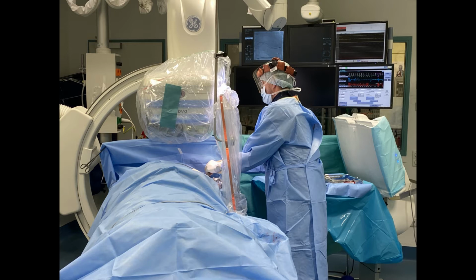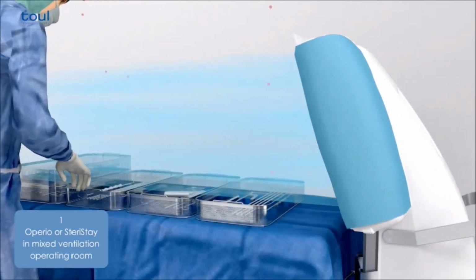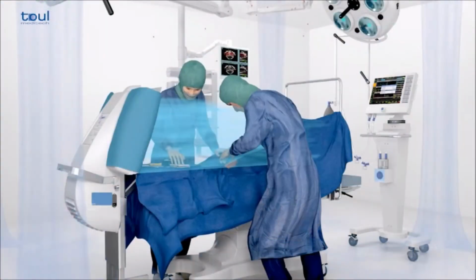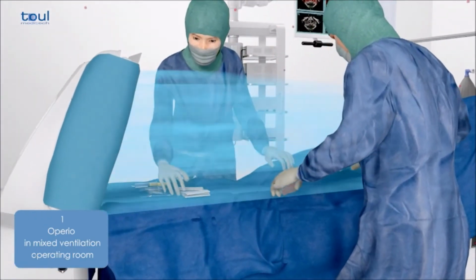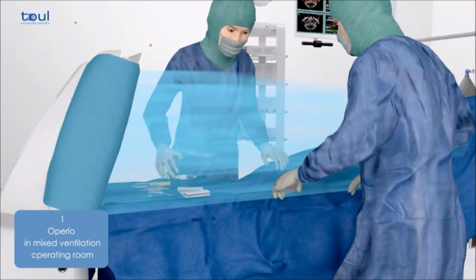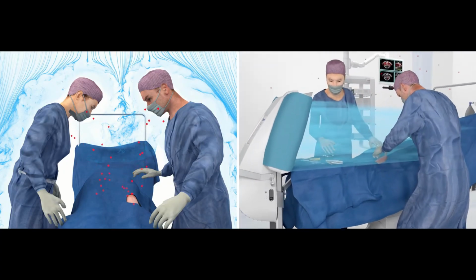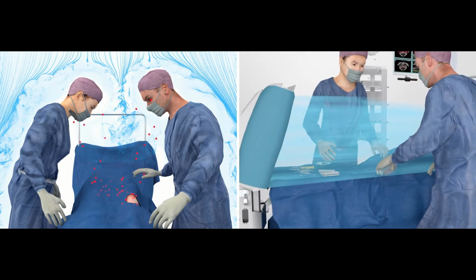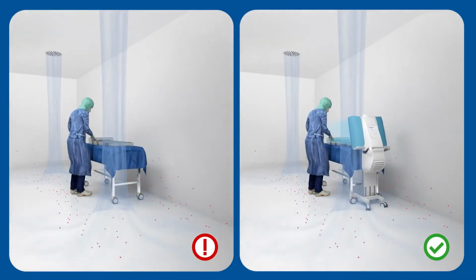Focused laminar flow. In the case of focused laminar flow systems, the air is filtered through HEPA filters free of microorganisms and then directed immediately onto the surgical instruments and surgical site. It is only then distributed throughout the operating theatre. This protects the critical area of the operating theatre, in other words, the instruments and the surgical site. With this system, the bacterial load on the instruments and surgical site is reduced by 95% compared with conventional ventilation systems.